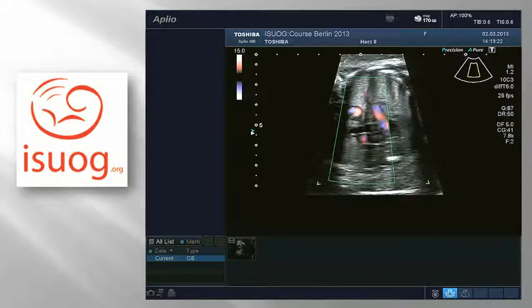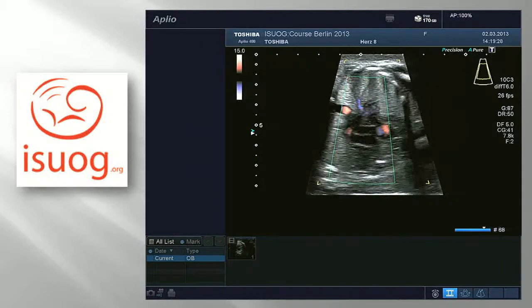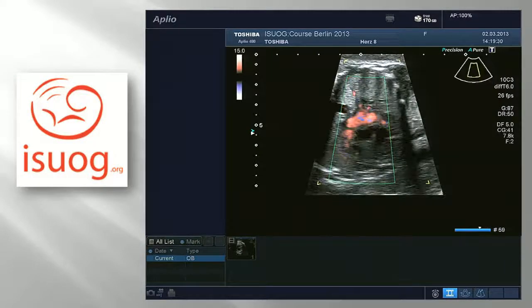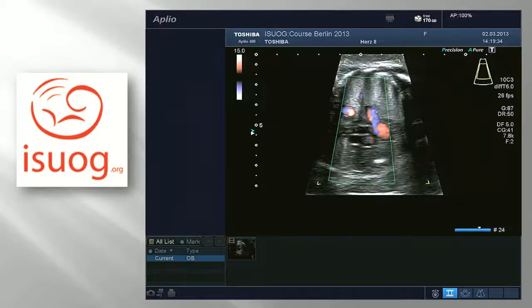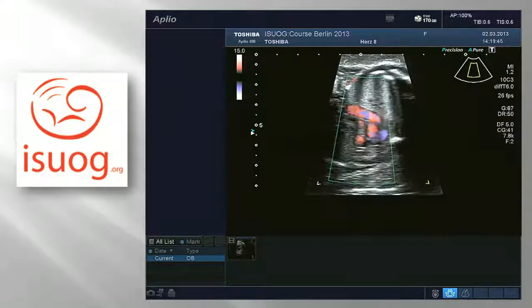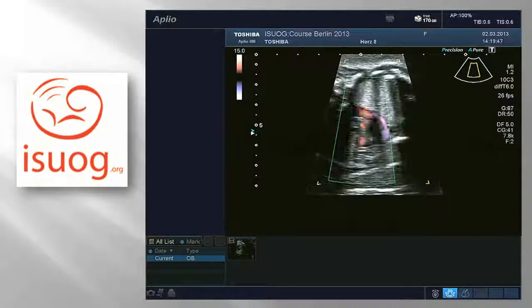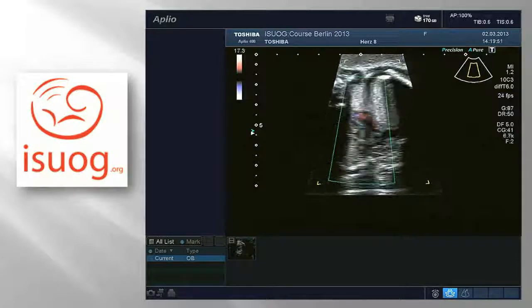Maybe I'll take the opportunity. And those are the pulmonary arteries when I wasn't looking for them. They're nice and clear. Okay, there we are. You see how important it is to freeze the image. Remember about the car going very fast? Once you see it there, you come back, and that's the left pulmonary artery and the right pulmonary artery. And then just a little bit higher from that, you have your arterial duct, and then the transverse aortic arch.